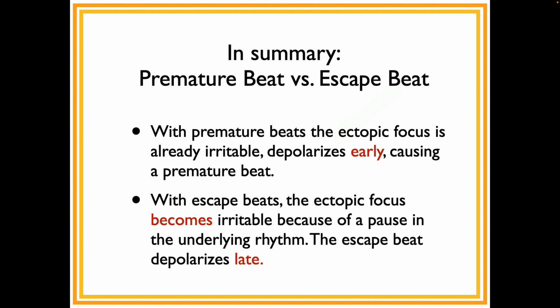And what you're going to do is, first of all, identify the rhythm. They're all going to be normal sinus, sinus brady, sinus tach, so it's good practice. And are there any ectopic beats? If so, are they premature beats or escape beats? You can do it by yourself or with your neighbor, doesn't matter to me.